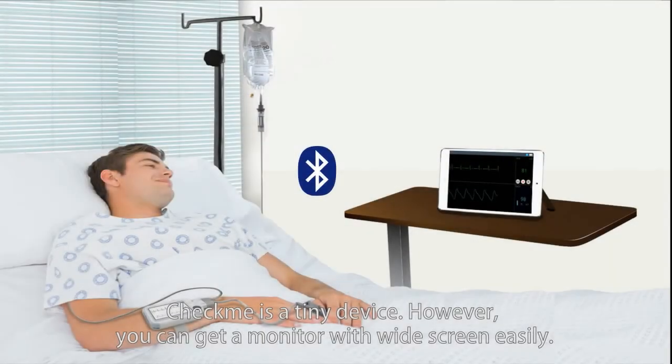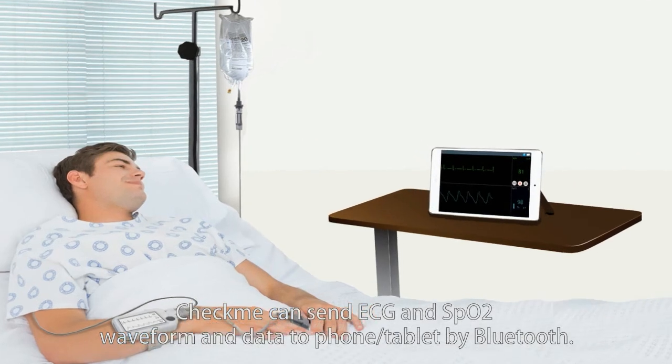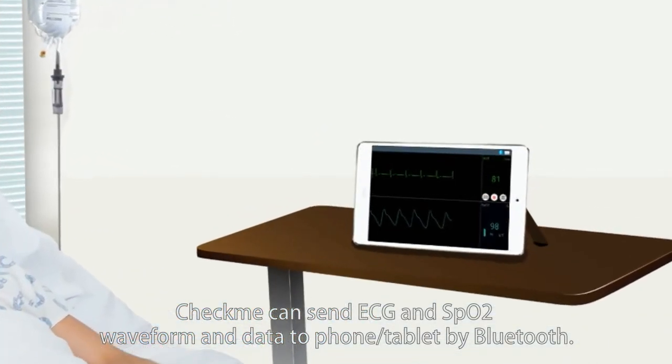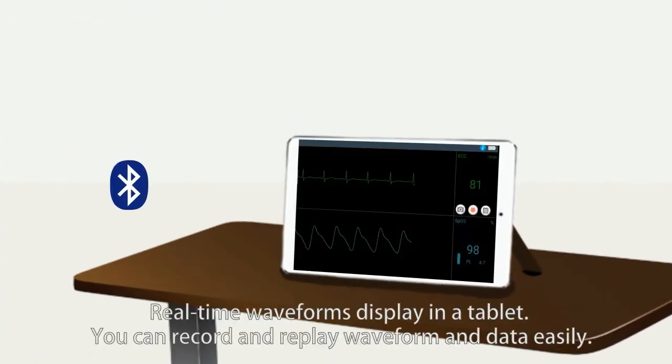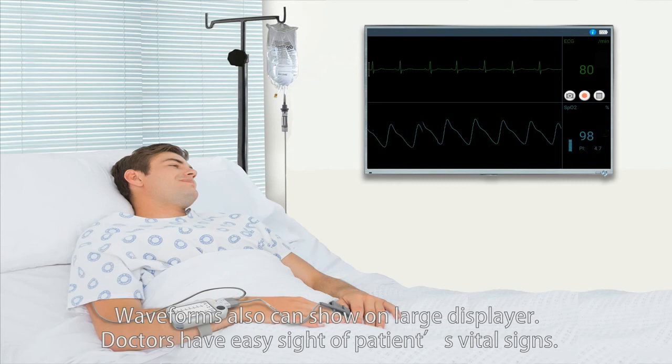CheckMe is a tiny device; however, you can get a monitor with a widescreen easily. CheckMe can send ECG and SpO2 waveform and data to a phone or tablet by Bluetooth. Real-time waveforms display on a tablet, and you can record and replay waveform and data easily. Waveforms can also show on a large display, giving doctors easy sight of patients' vital signs.